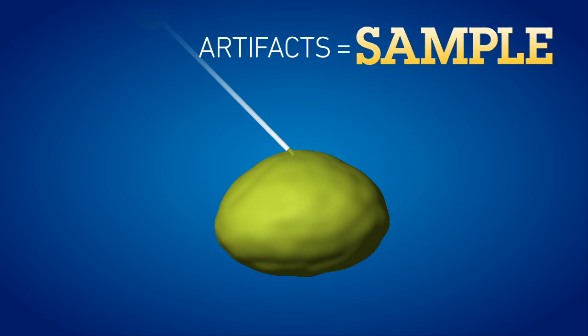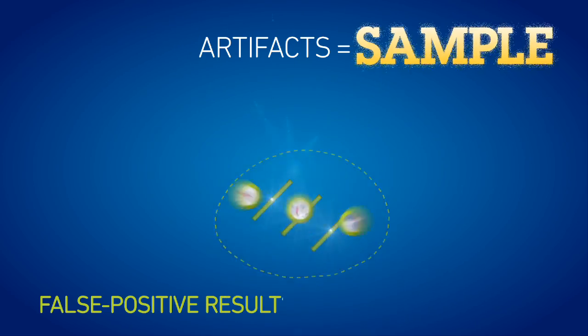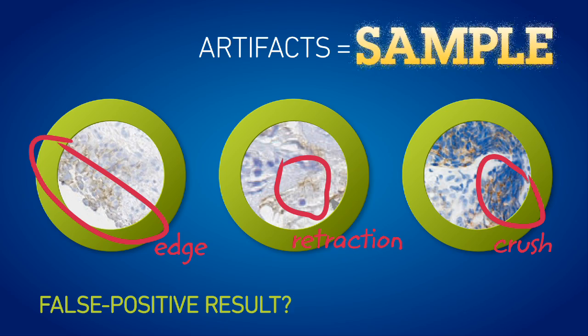Core needle biopsies may cause artifacts that can be seen under the microscope. They can be falsely interpreted and create a false positive result. Any sample with artifacts should be rejected.